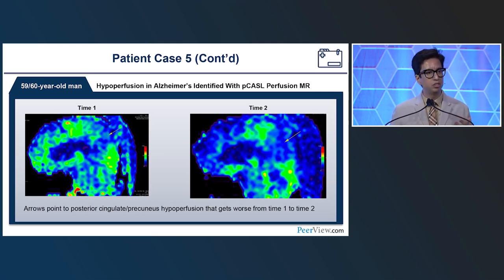And so this, in conjunction with progressive atrophy, really helps improve the confidence in understanding the presence of neurodegeneration related to Alzheimer's disease, which is really what atrophy, ASL, and FDG PET should be tracking.